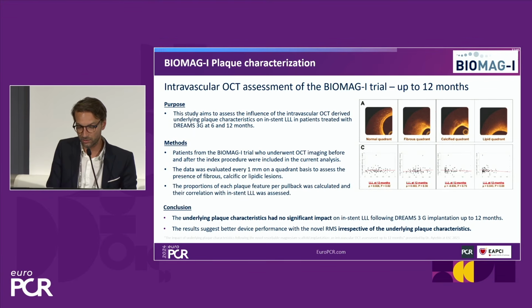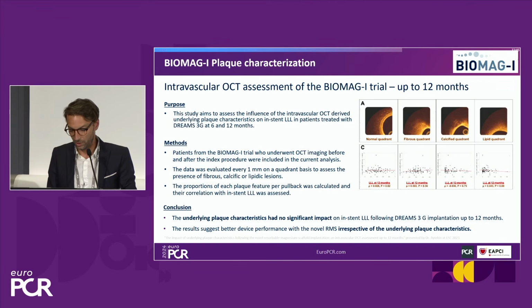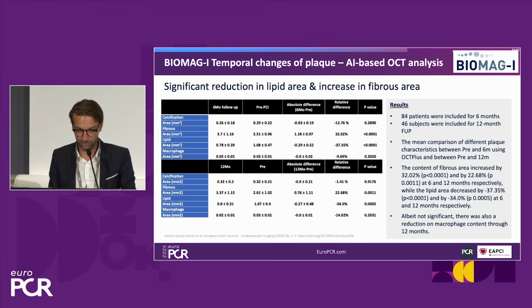The sub-studies imaging showed that the underlying plaque characteristic had no significant impact on late lumen loss in the FreeSolve, suggesting a better device performance. And although it was a low number of patients, vasomotion was restored at 12 months as well.